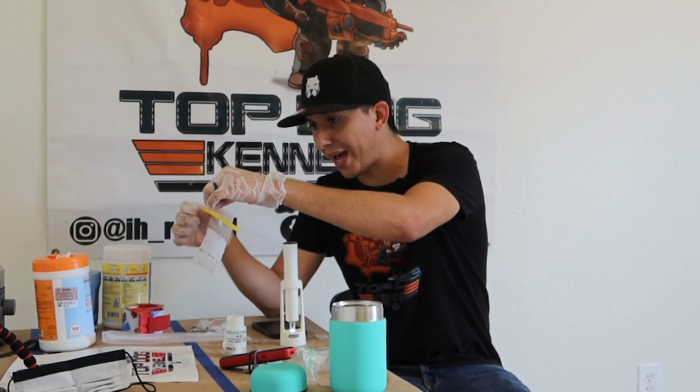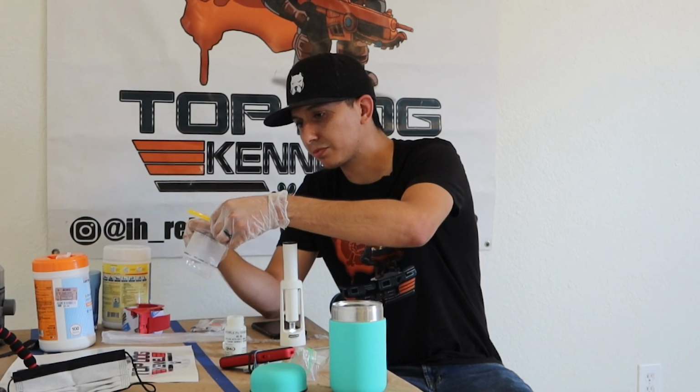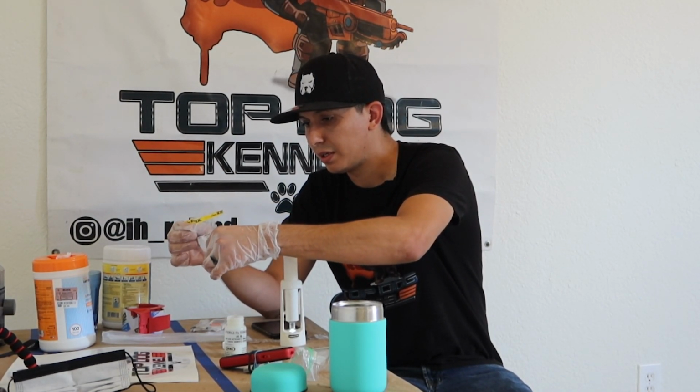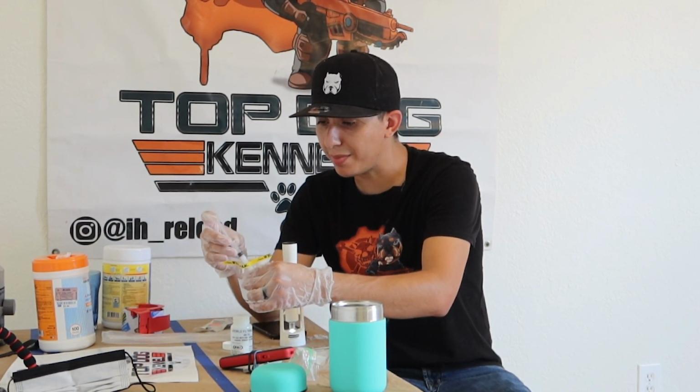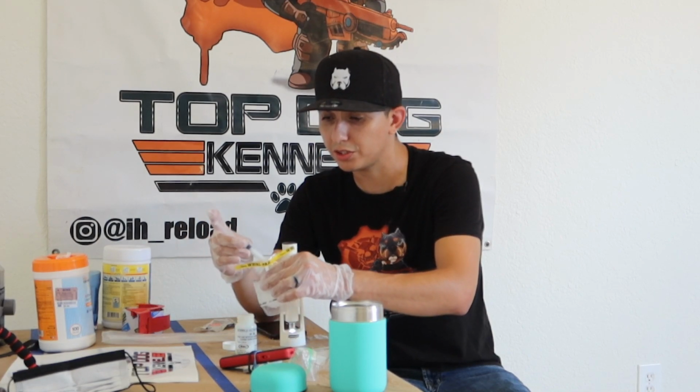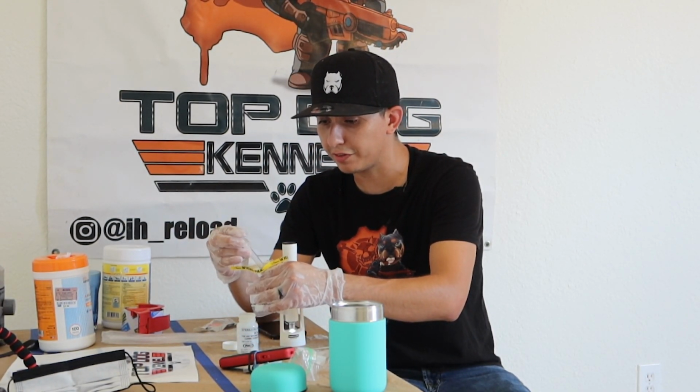Next, you need a sterile package so you can package this up and ship it out. Brand new one. You open this up. You collect the sample. By the way, you want to mix your extender with the semen at 4 times the amount of extender to semen. So if we got 3 mLs, you want to do 4 times that. I don't do math on camera, but I'm pretty sure we can get that for you, which would be about 15 mLs that you want to put there. So 12 to 15 mLs is what you want to do there.